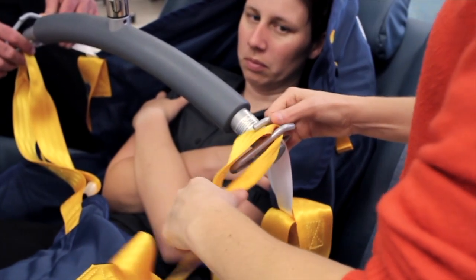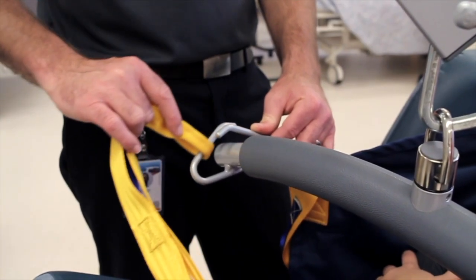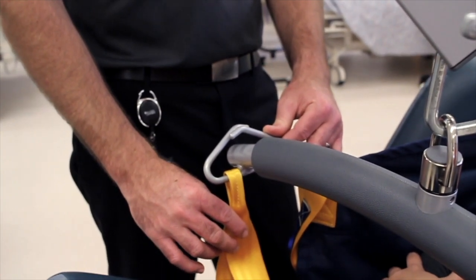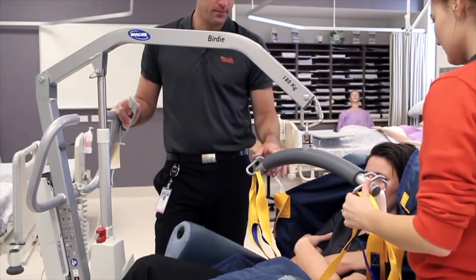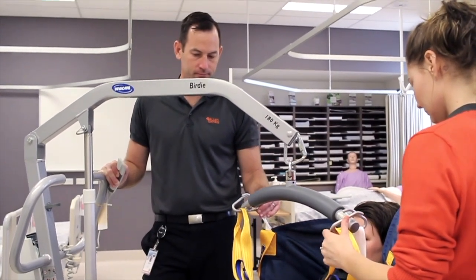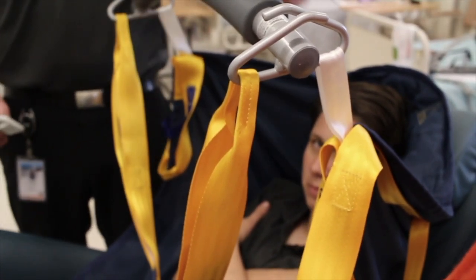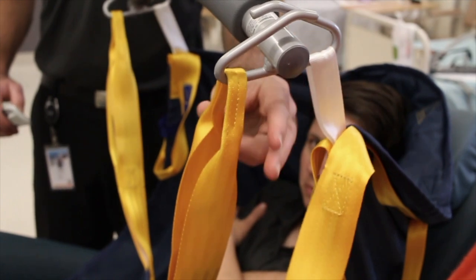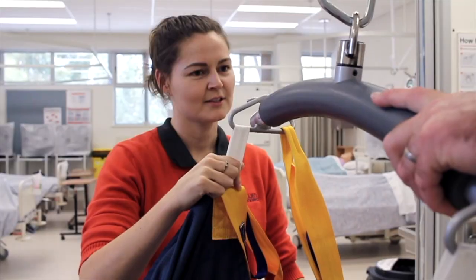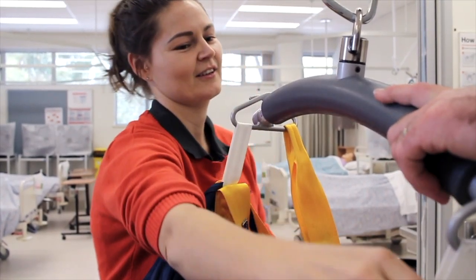We then grab the leg straps and cross them over — typically on a yoke frame hoist, though there are some exceptions. We put the loops through and make sure that they are all the way on so they're not going to slip off during the transfer. We'll raise the boom until it is slightly weight bearing, and then one staff member will check their own clips and cross-check their partner's to make sure they're the same size, same length, and secure.